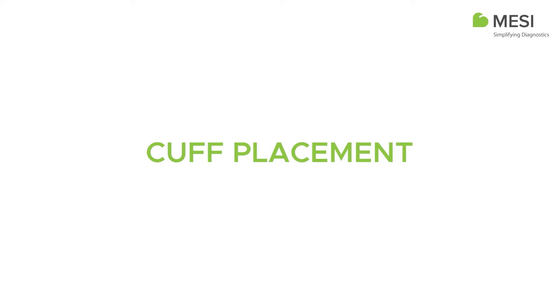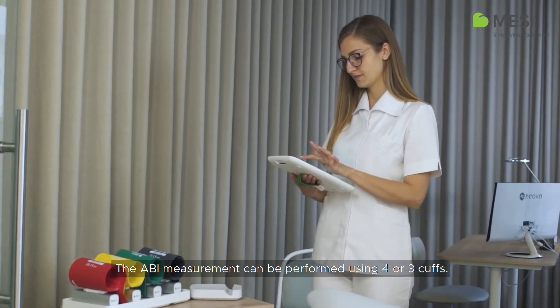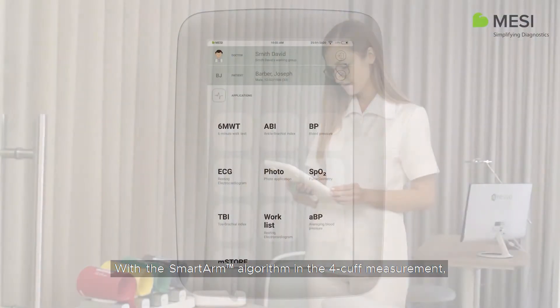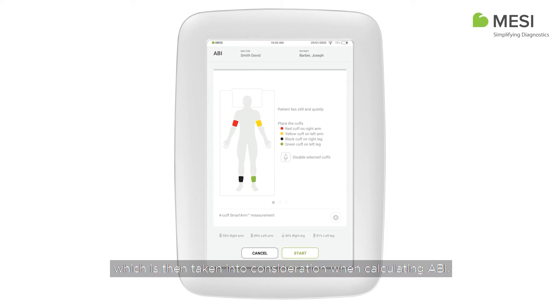Cuff Placement. The ABI measurement can be performed using four or three cuffs. With the smart arm algorithm in the four-cuff measurement, the device automatically detects the arm with higher systolic blood pressure, which is then taken into consideration when calculating ABI.